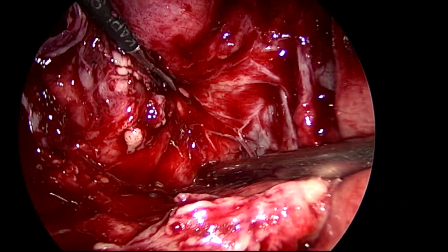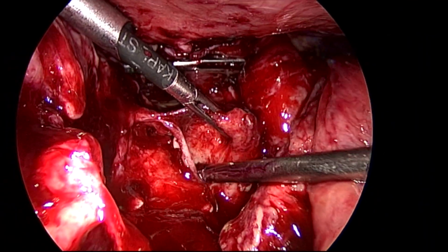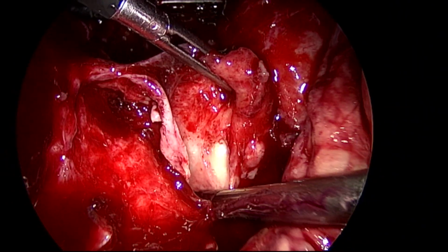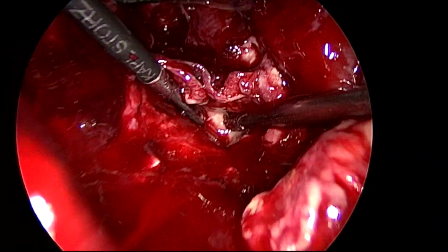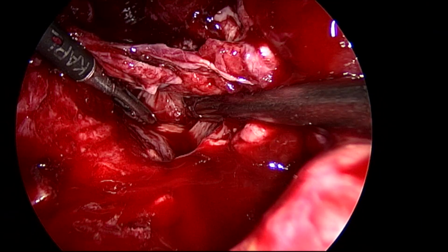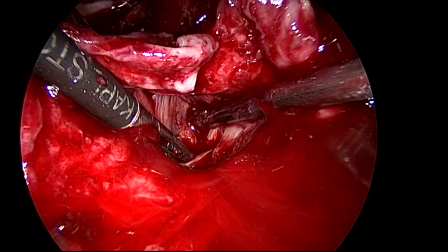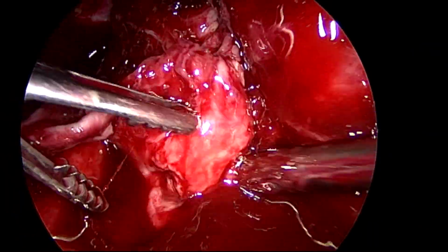And you can see it is a very distended, thick-walled, perforated gallbladder. Even though it is perforated, it is a very distended and thick-walled gallbladder. And I could see the abscess in the gallbladder wall. You can see the wall is white in color. That means there is an abscess. That's why it's called empyema of the gallbladder.